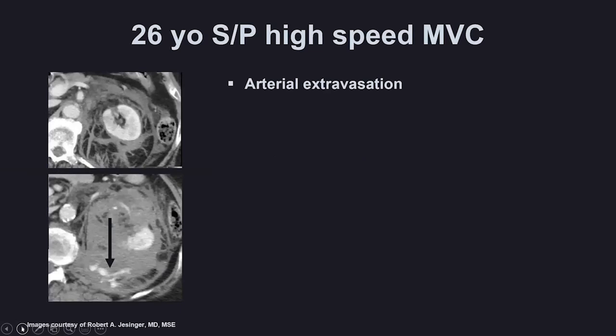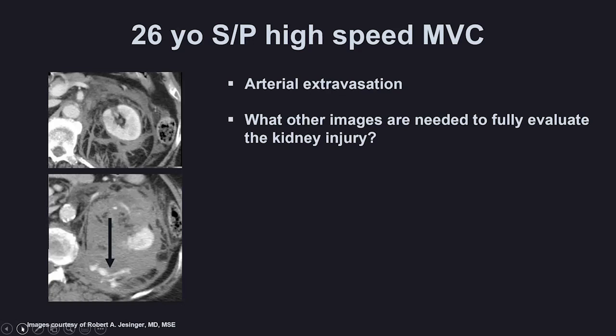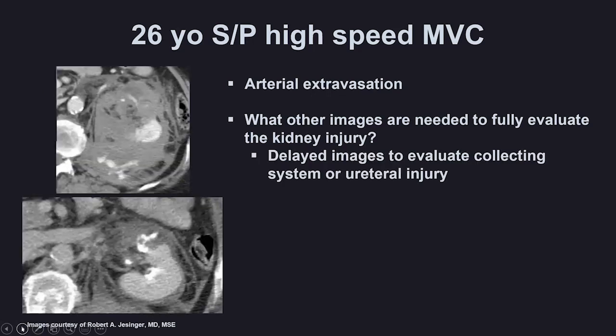Case seven: a 26-year-old with a high-speed motor vehicle collision showing arterial extravasation on the lower image. To fully evaluate the kidney injury, delayed images are needed to evaluate the collecting system. With a renal arterial injury, patients can have more than one injury to the kidney. In this case, there was also a collecting system injury on the same side, which can change how these patients are managed.